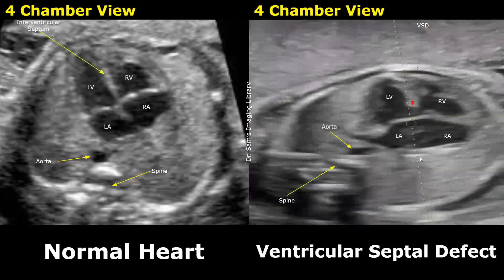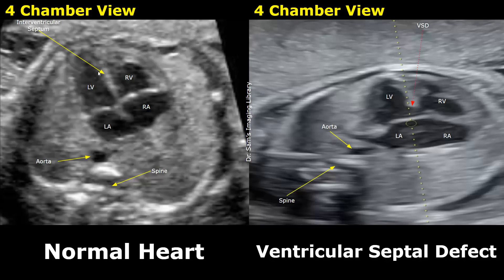The septum or wall between the right and left ventricle is the interventricular septum. In a ventricular septal defect, there is a hole or defect in this interventricular septum. This defect can be associated with Edwards syndrome.